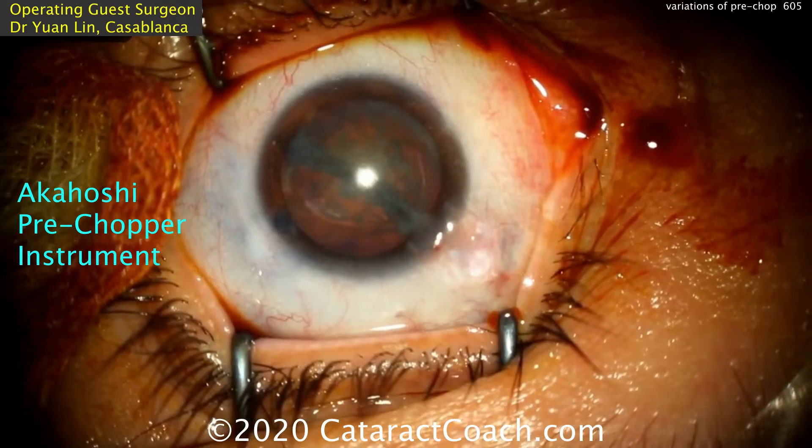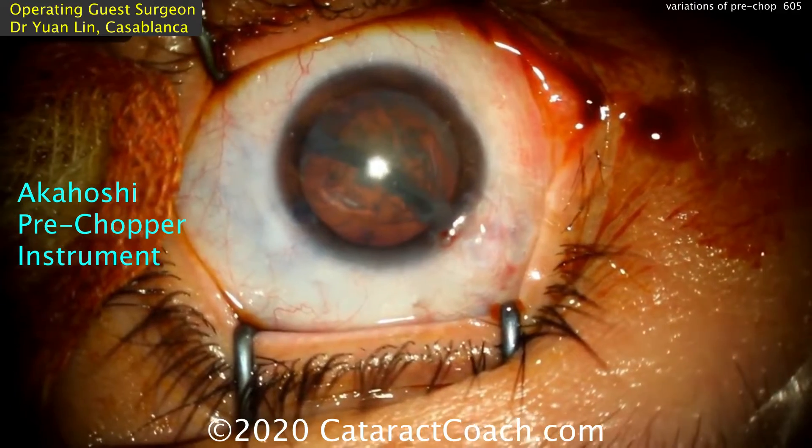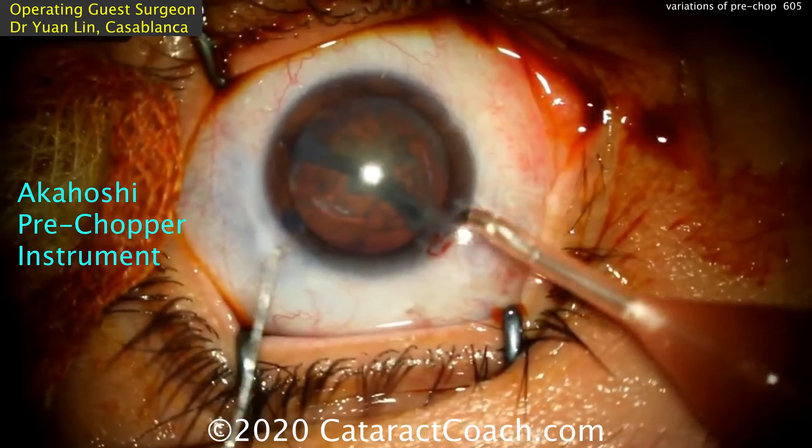You can rotate the lens and split it even again. So the pre-chopper is certainly a neat technique. Thankful to Taka for the great invention.